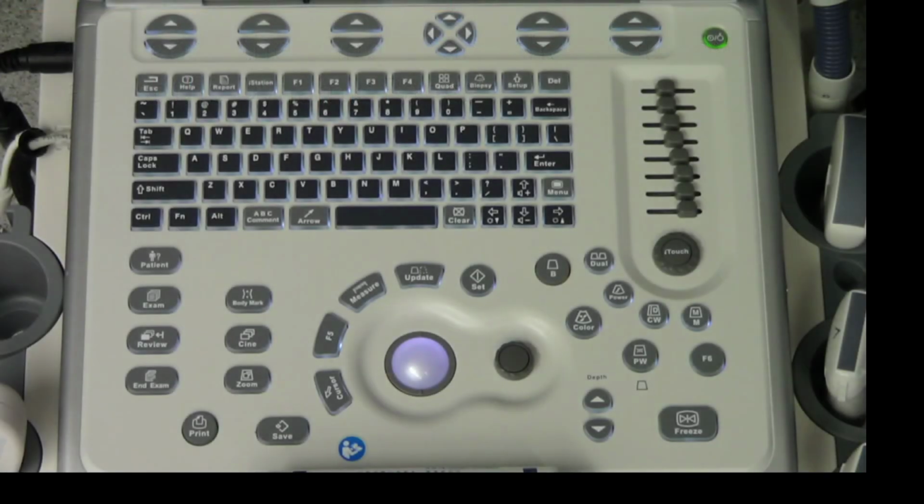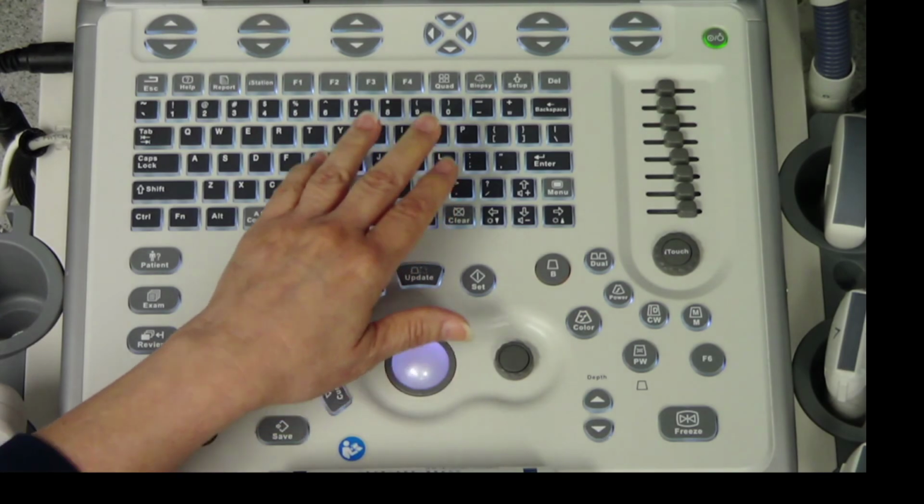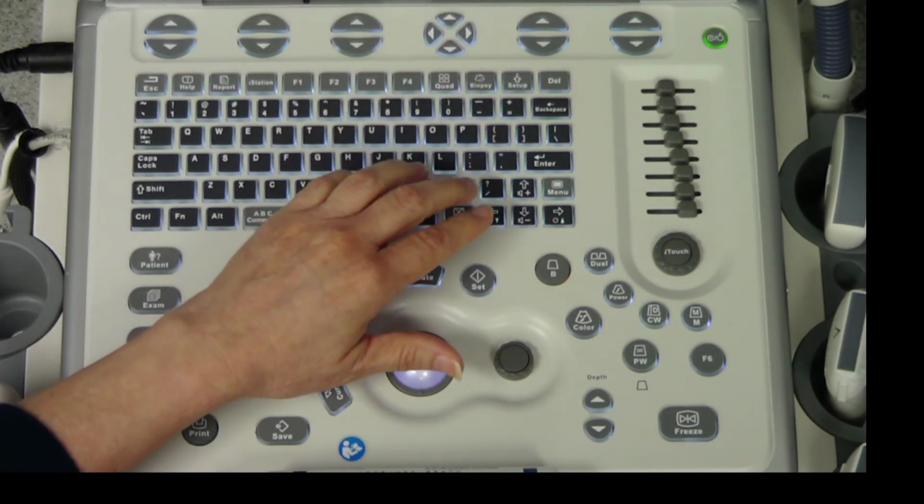So let's go to the Mindray now so that you can see where I'm adjusting that. If we look up at the screen, this needs to be moved.